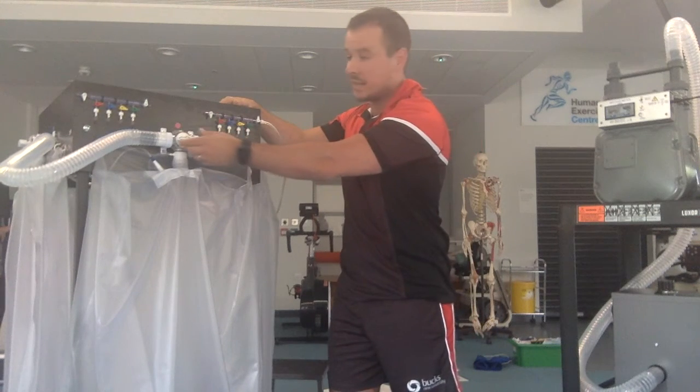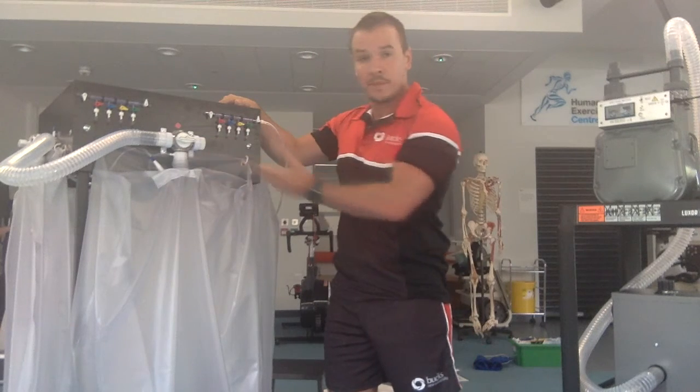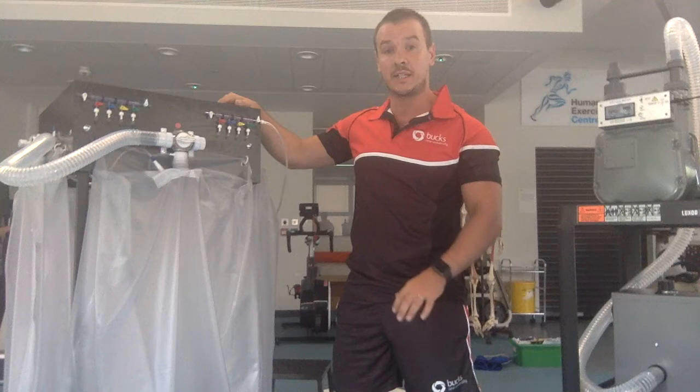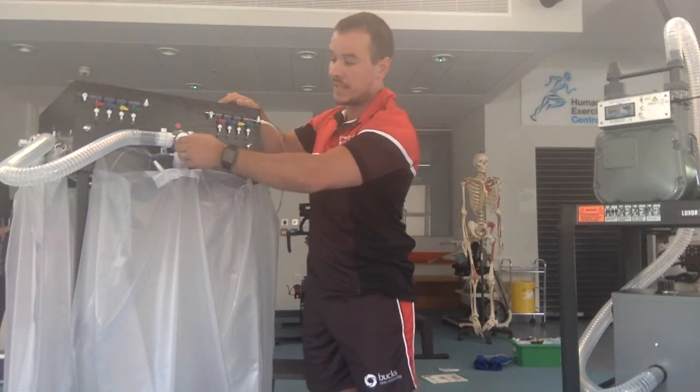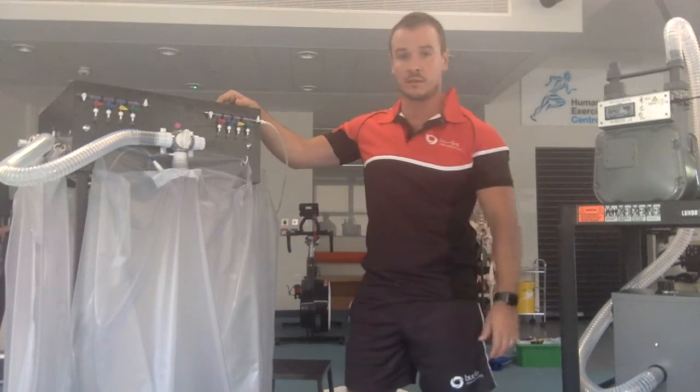You'll notice that each of these Douglas bags has a tap at the top. When the tap is horizontal, the bag is sealed and no air can pass either in or out. However, when I turn the tap to the right, I open it so the air can pass in or out freely.